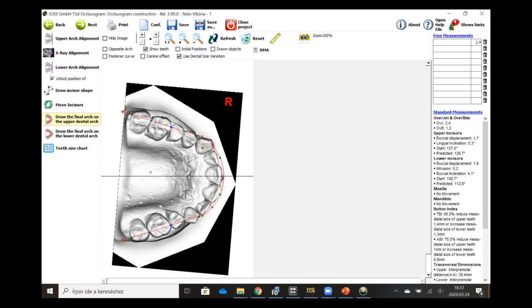Okay, in this way you are not, I don't know what's happening. Okay, I don't like it, but just to tell you. If I put it like this, there is basically no expansion in the premolar area. Maybe I would expand a little bit, but maybe something in the middle, what you had decided.